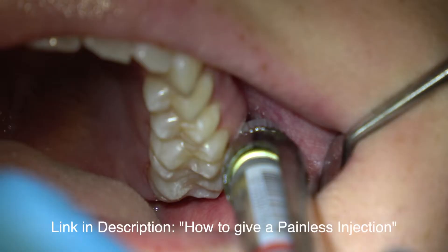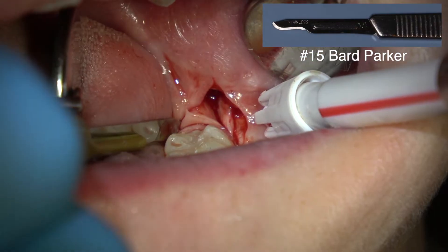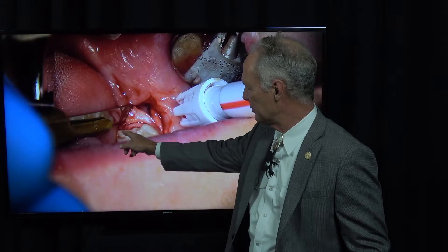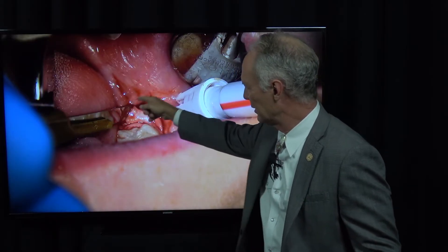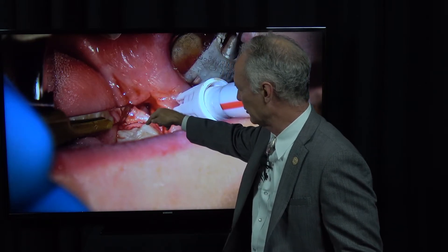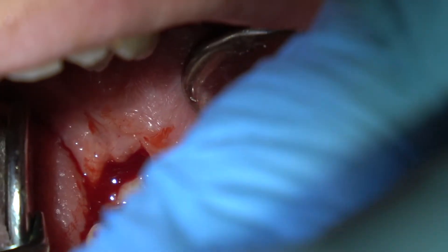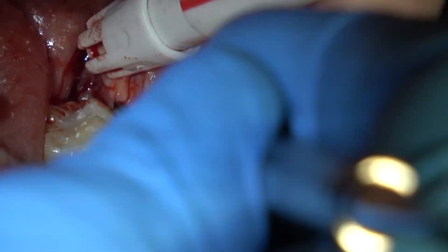For local anesthesia, you can refer to that link on how to give a painless and profound dental injection. I'm first going to cut a wedge back here. Don't go far to the lingual — you just want to go to the distal lingual of this tooth. If you go too far to the lingual, you might damage the lingual nerve. I want to cut here and across the distal of this second molar and take that wedge out so I've got space through the gingival tissue to move those pieces.